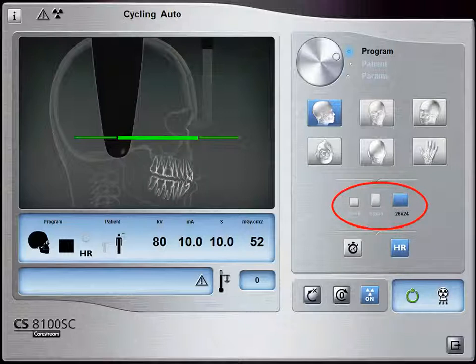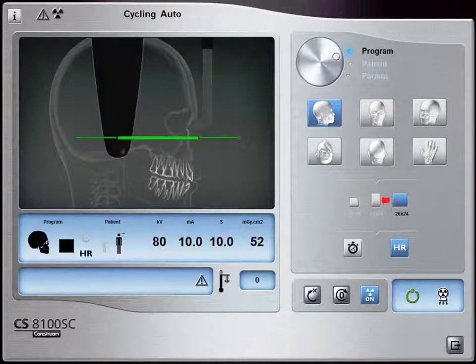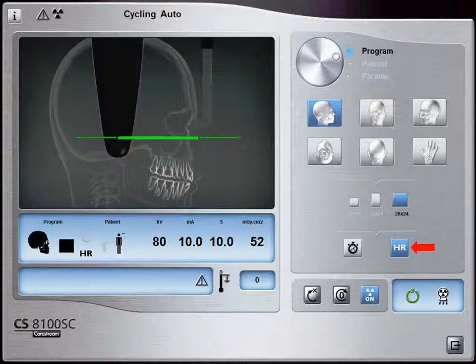Acquisition Format Options: Select the 18x18 icon to acquire an 18x18 format. Select the 18x24 icon to acquire an 18x24 format. Select the 26x24 icon to acquire a 26x24 format — not available on Access Version units. Select the FastScan icon for a quick exam, or select the HR icon to acquire a higher resolution exam for more precision.